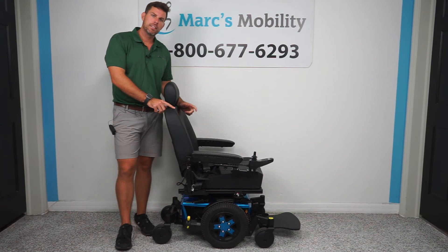Hey, my name is Alex from Marc's Mobility, and in this video we're going to show you a Quantum Edge 3 with a pan seat, so stay tuned.